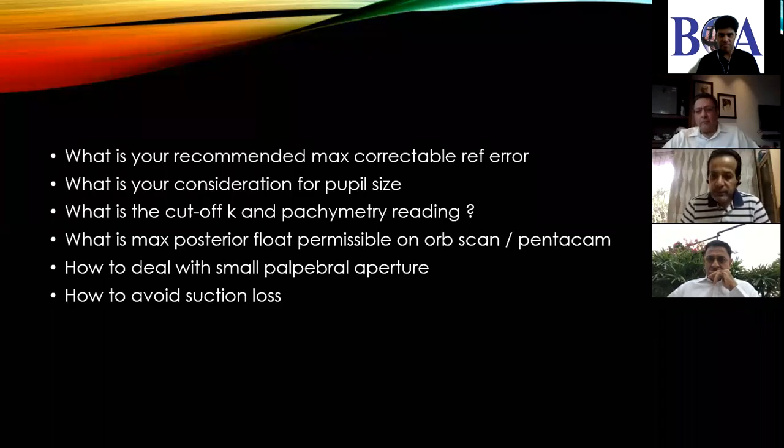Anything to add, Bajar? Yeah, now only for the experienced surgeons, you could do the LASIK without a speculum. Right, yes, that's true. One more thing, we could change if it's an M2 keratome. You could keep it temporal. If it was the previous microkeratome, we had a superior flap. You could keep a temporal flap. So I think this covers this point, Swapnesh.